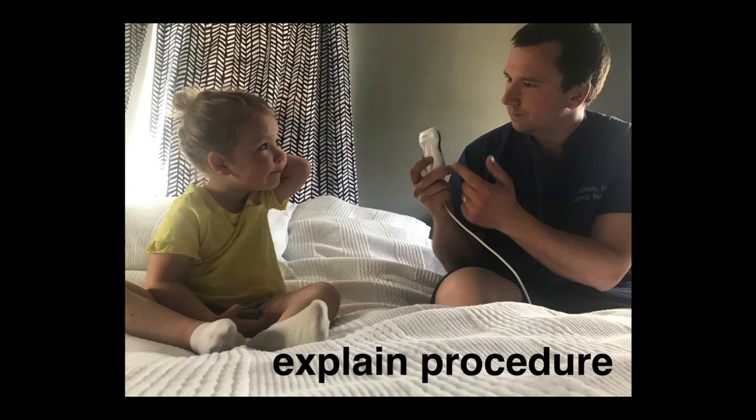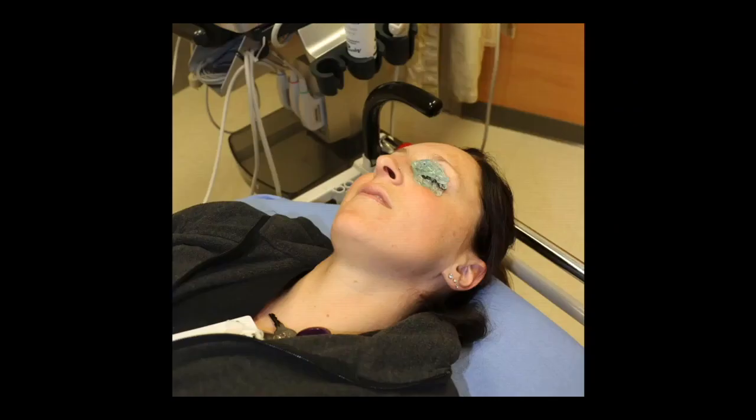You have to let them know that you're going to be placing gel on their face, that you're going to want them to be holding still, and you're going to be asking them to move their eye in multiple directions, just so they're not all of a sudden surprised when you're doing this. It just makes for a little bit smoother of an exam. So when you position your patient, they can either be supine or upright or somewhere in between.